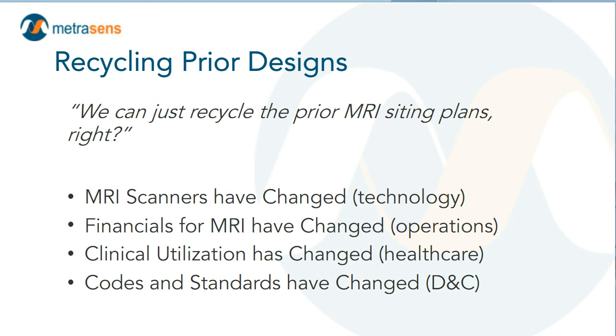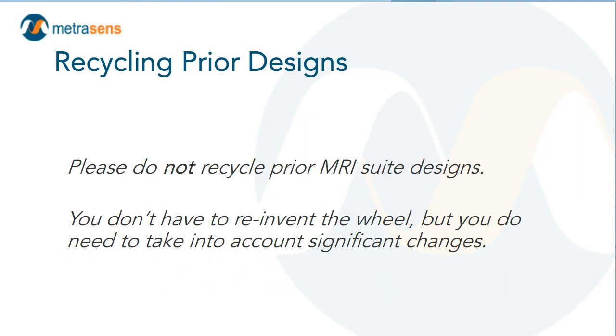So, please, please, please do not recycle prior MRI suite designs. Now, that doesn't mean that you throw out the good ideas that you had from 10 years ago or whenever. Absolutely, recycle good ideas, just don't recycle the whole plan. Reassess your needs and redevelop a plan based on those needs.